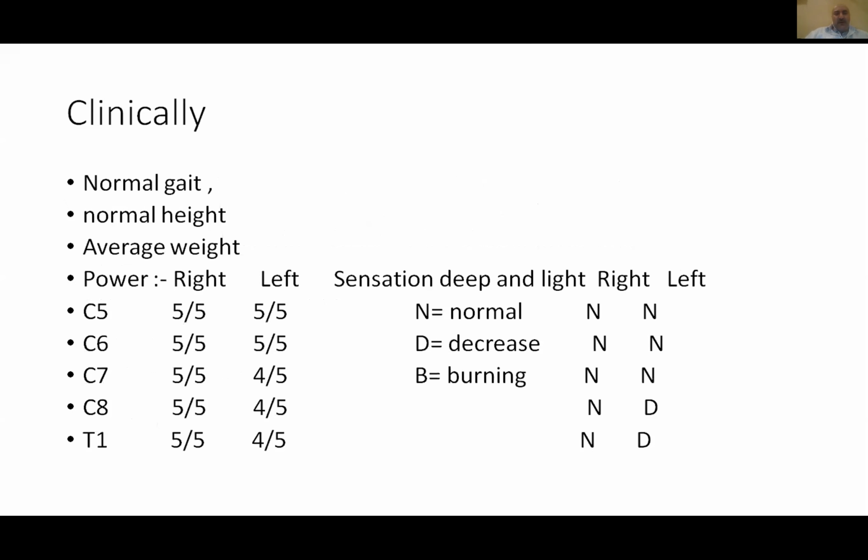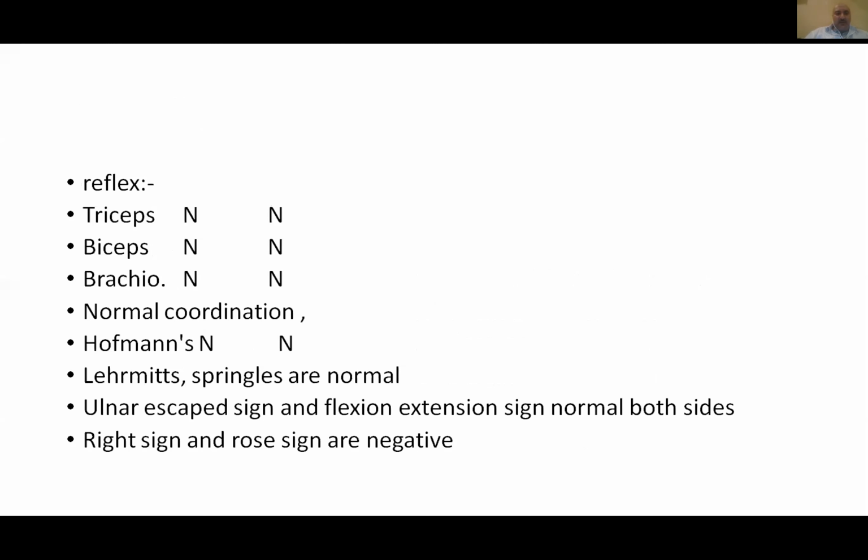So I examined him. I examined the upper limb because his complaint was at the upper level. It showed that he had weakness from the cervical level down to T1, although his fracture is at T4 and 5, sorry, which is not related to the symptoms. Some of the surgeons suggested doing a revision for him, but I will show you something interesting.